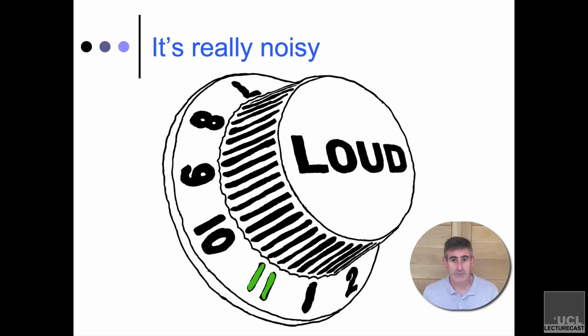So the way your speaker works, or your earbuds work, is that there are magnets within magnets, and by changing the magnetic fields, you can actually cause it to generate sound. Well, that's exactly what a scanner does as well. There are magnets within magnets that are producing these sounds. The sounds aren't the interesting thing. We need the changes in the magnetic field in order to record the BOLD signal, but it has the consequence that it makes a lot of noise.